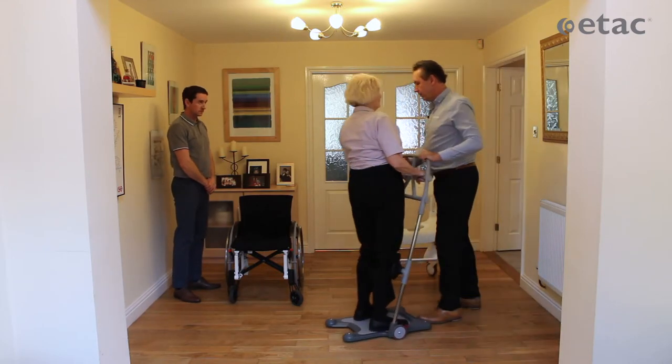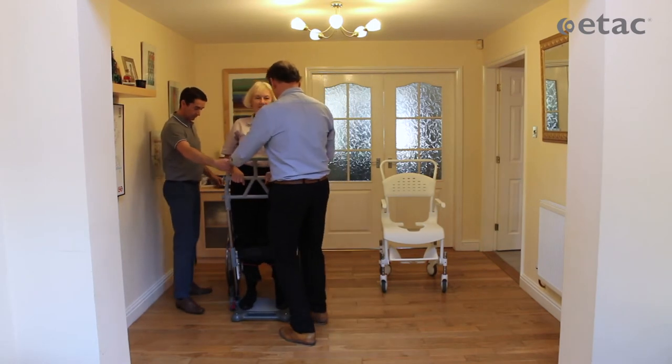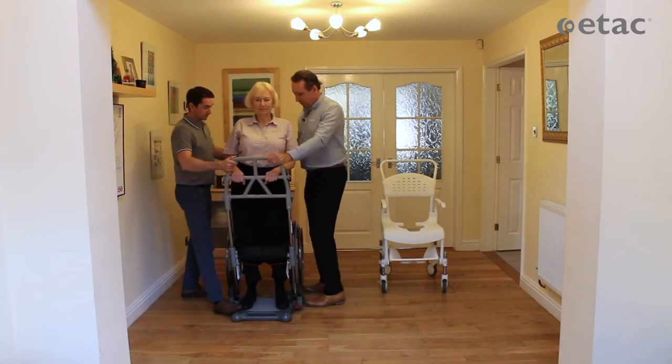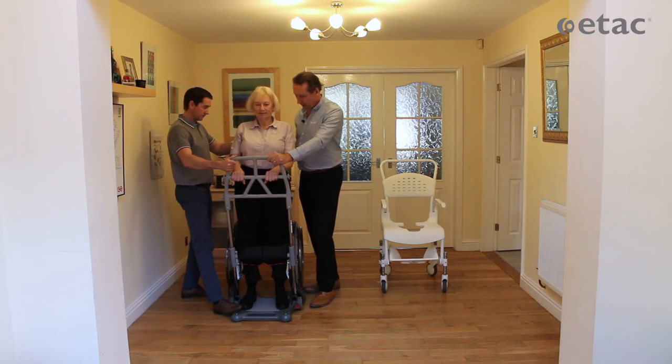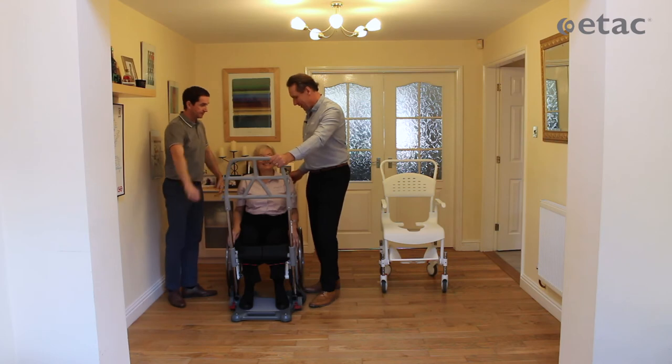You just look at me — there we go. I'm just going to put the brakes back on. You'll feel the chair just behind your legs, and when you feel comfortable, sit back down. Okay, that's it. Sit down. Perfect. Thank you. That's us done.